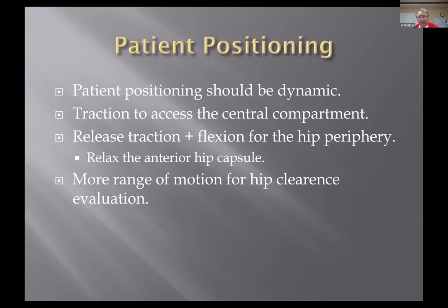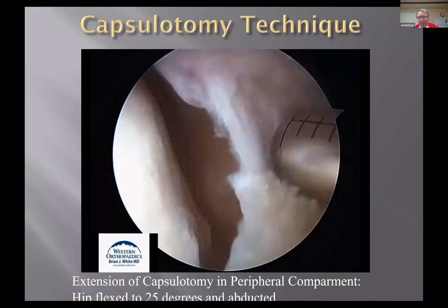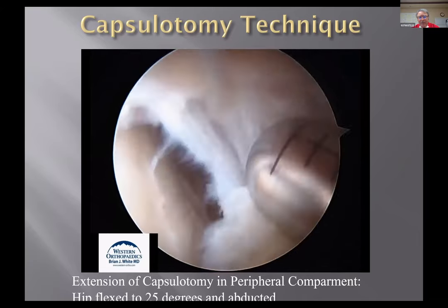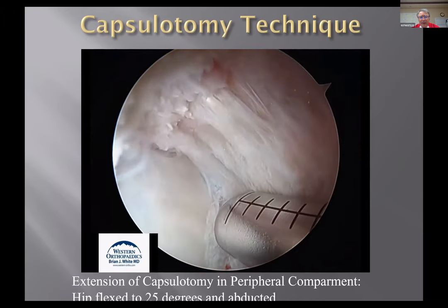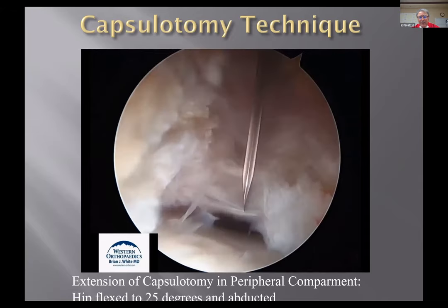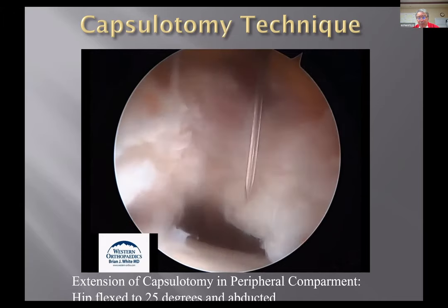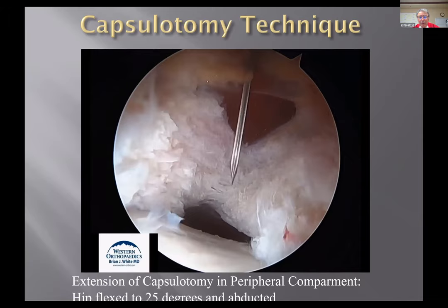We always know that that's going to be a dynamic repositioning then. We're going to release our traction. We're going to flex the hip to take the capsule tension off. And that's going to allow us to get into the peripheral compartment and assess where we have it. So there's a cam lesion. He's lifting the capsule up here and making sure that he can get exposure for his instrumentation to begin his peripheral compartment. The hip is flexed at this point, traction's off. That's good for nerves.